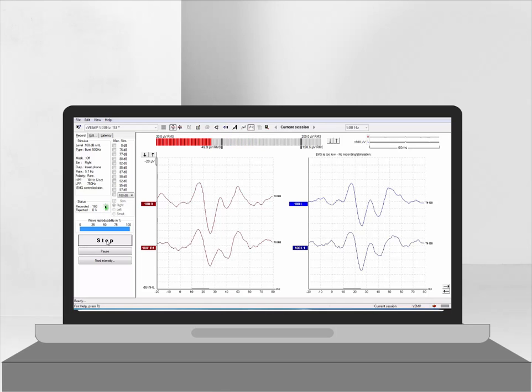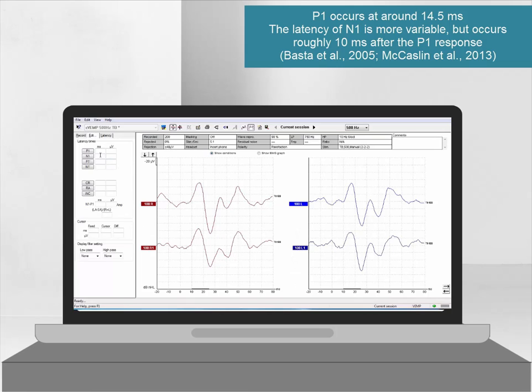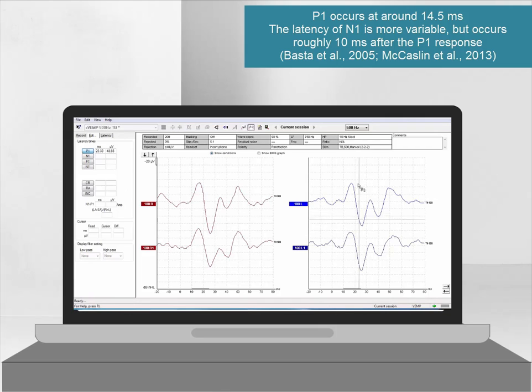Now it is time to mark the waveforms. When using a tone burst in a healthy individual with an intact vestibular system, the P1 will occur at around 14.5 ms. The latency of the N1 can be quite variable but is often found 10 ms after the peak of P1.